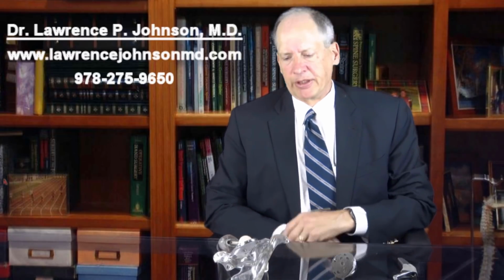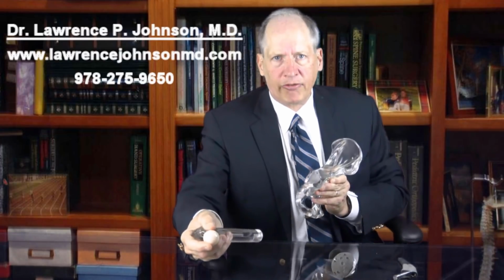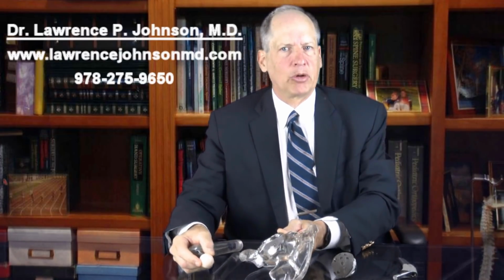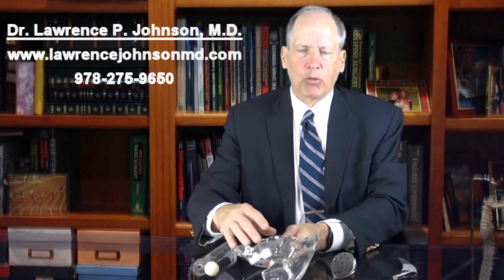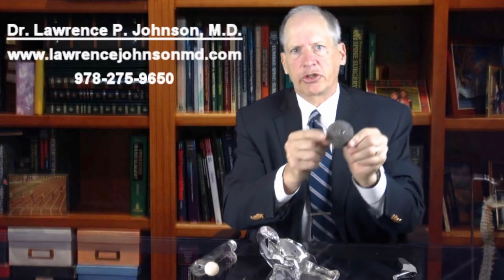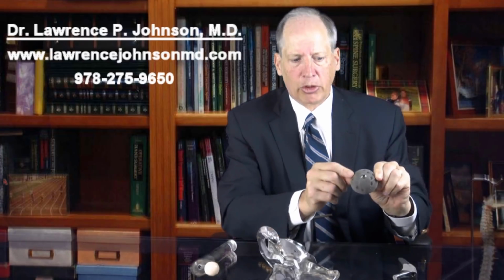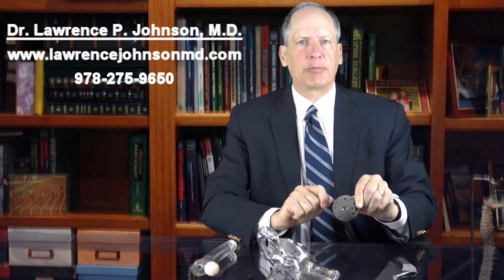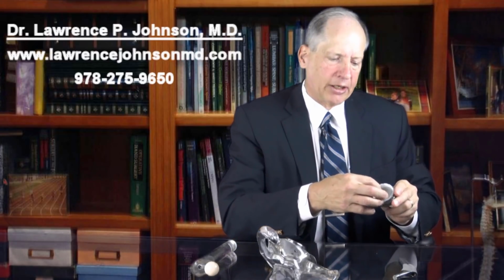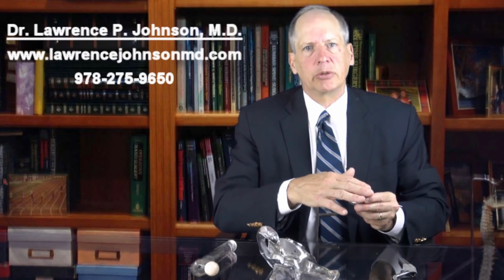So basically a hip replacement operation is performed by resurfacing the socket of the pelvis and putting in a new femoral component in place of a diseased femoral head. So basically what we're doing is putting a socket in, which on the outer surface is titanium, which goes into the socket, and bone loves to grow onto titanium. We also have these holes here where we get immediate fixation by putting in a couple of screws to fix it. Then in the liner of the socket we have high density polyethylene or ceramic sometimes in order to resurface the hip.